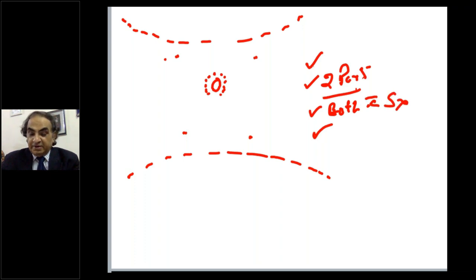Third, mandatory to document. If you're recording it, you can say, I don't have a facility in my laparoscope, my system. So you can record it from outside, but it has to be recorded and documented. Very, very important.